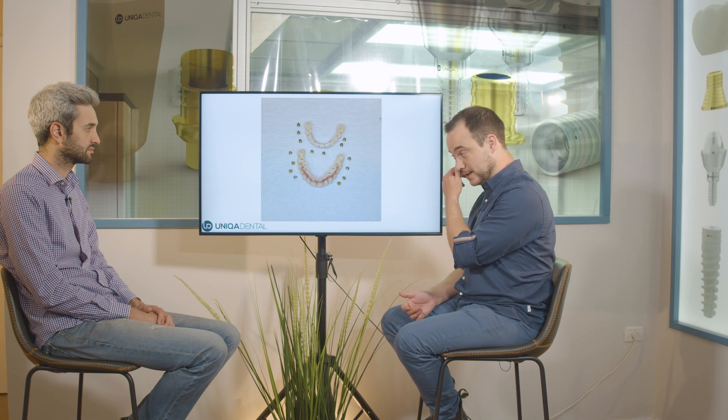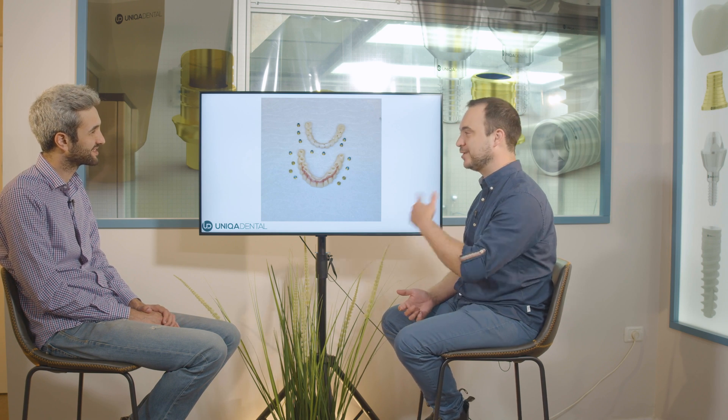In the zirconia bridge, because the height of the teeth is very large, we added gingival-color glaze on top of the upper bridge since it's visible when he smiles. It's quite a lot of glazing because the teeth are quite big — though smaller than what he had before. We did the pink color glazing chairside.